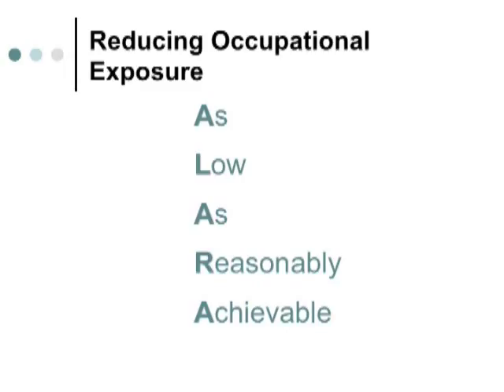Okay, so what's the take-home message of everything that I've been saying today? It's the same thing, is that we want to try to keep the dose as low as reasonably achievable, because any amount of radiation has a risk associated with it for some form of harmful effect. But for the most part, it's beneficial to our patients, right?